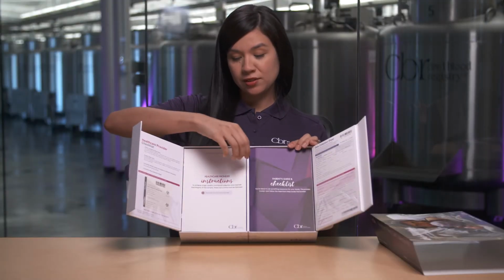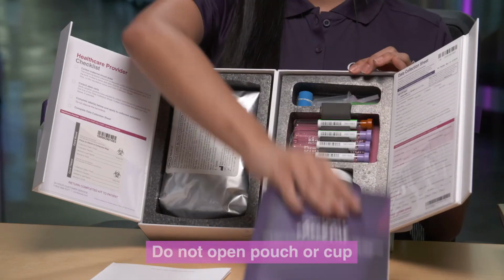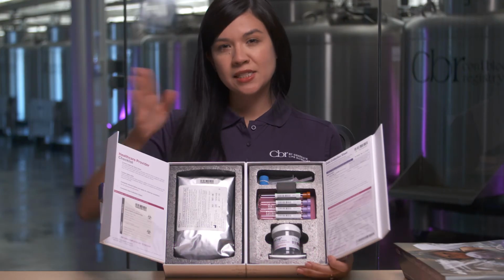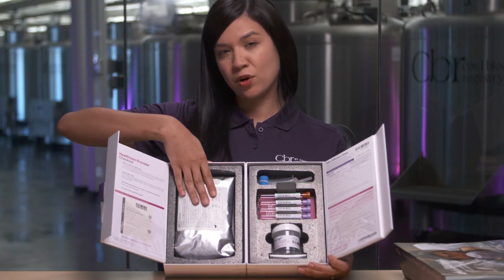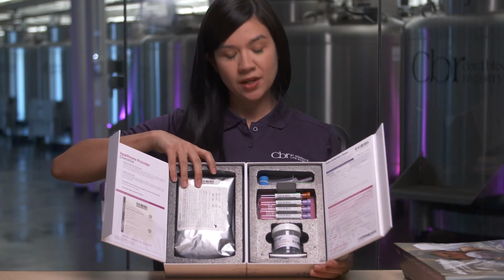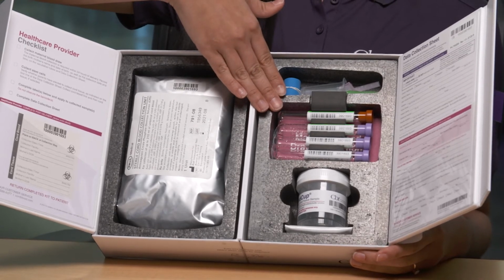Behind the instructions are the materials for the cord blood and the cord tissue collection. These are sterile, so please do not open either of the items. This is the pouch that your doctor will use for your cord blood collection, and this is the collection cup for the cord tissue. These last items here are your maternal blood draw tubes.